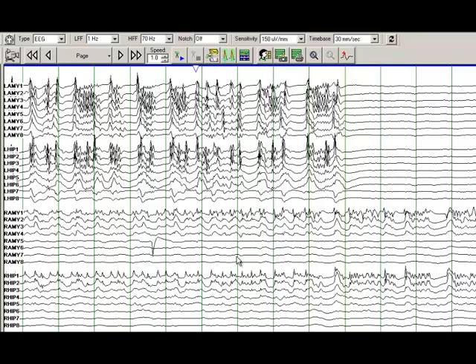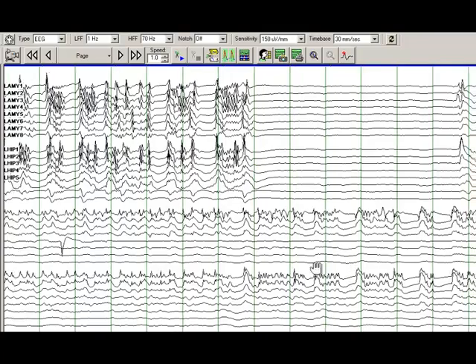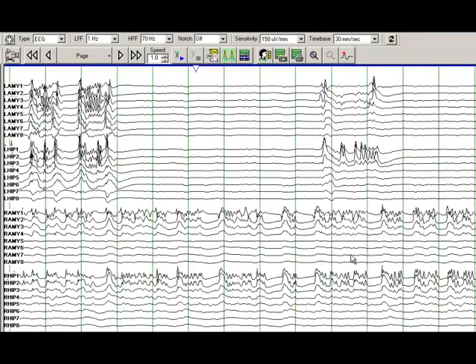As we go on with the seizure, there is an abrupt cessation of electrographic seizure on the left hemisphere. So this is the left amygdala and left hippocampus. Seizure stops here and continues to evolve on the right hemisphere.